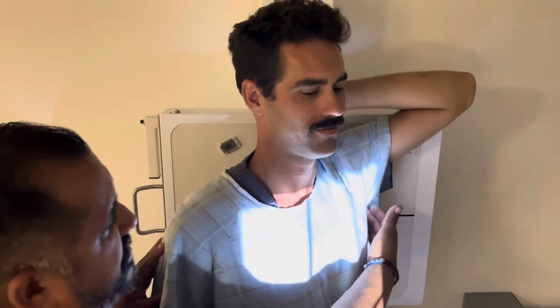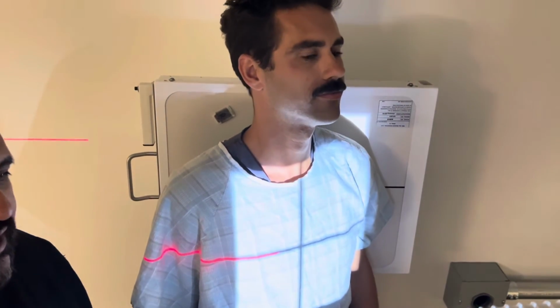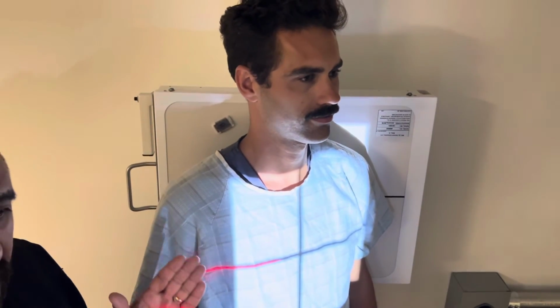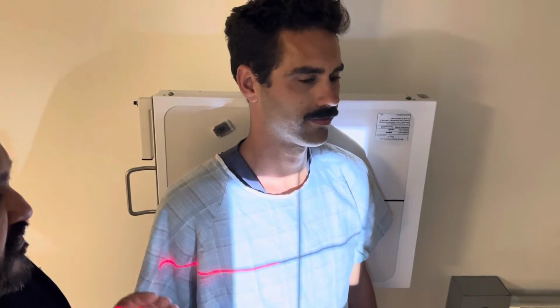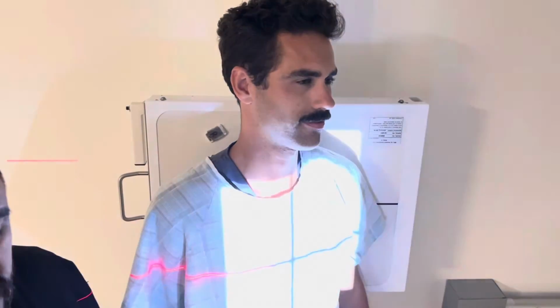Okay, you can relax. Now again, if this was an axillary rib injury, you can do an LPO as well. So again, LPO, left posterior oblique positions, can be used if you had a left posterior rib injury or you had a left axillary border rib injury. All right, so we usually do posterior obliques.